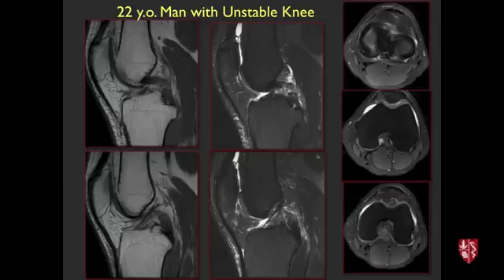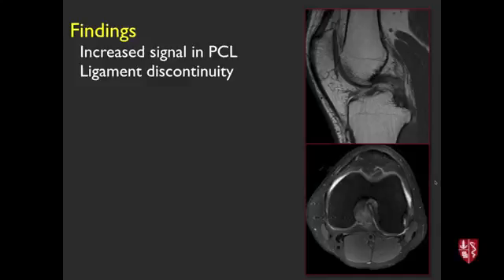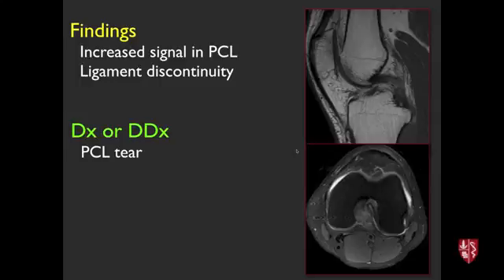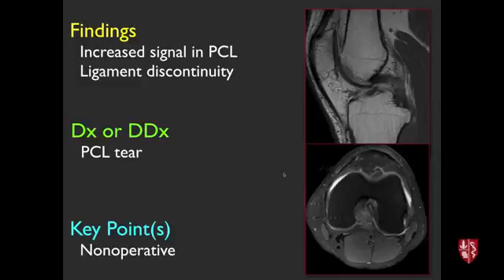Next case, 22-year-old with unstable knee. On MRI there's increased signal within the posterior cruciate ligament with ligament discontinuity, and on axial images the PCL is not seen as a thick black cord. This is a PCL tear. These are usually treated non-operatively unless there is a combined ACL and PCL tear; surgeons still usually reconstruct the ACL but not necessarily the PCL.